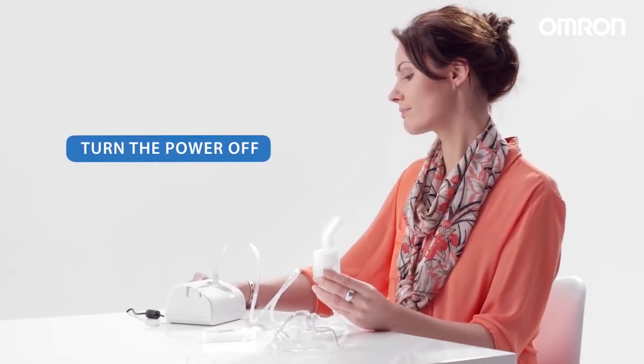Turn the power off after treatment. Check that there is no condensation or moisture in the air tube and unplug the device.